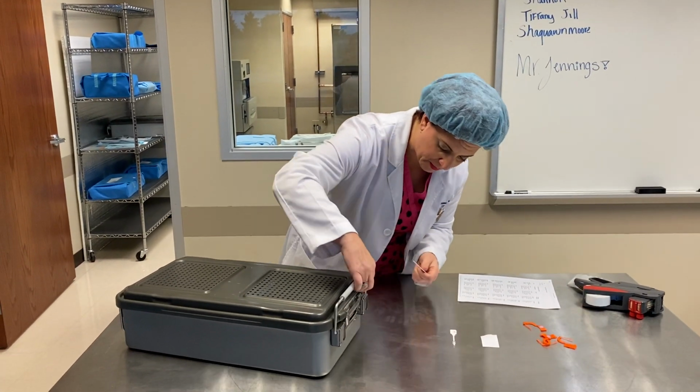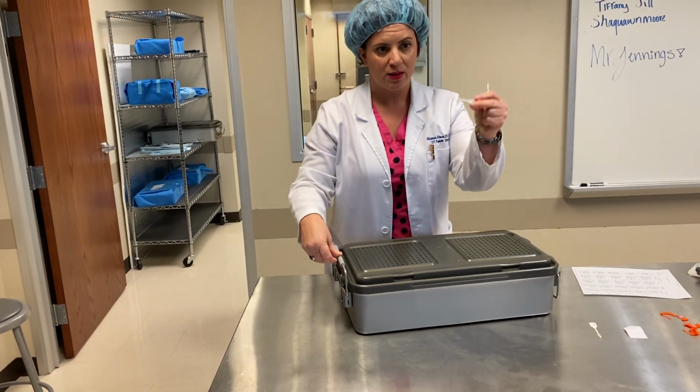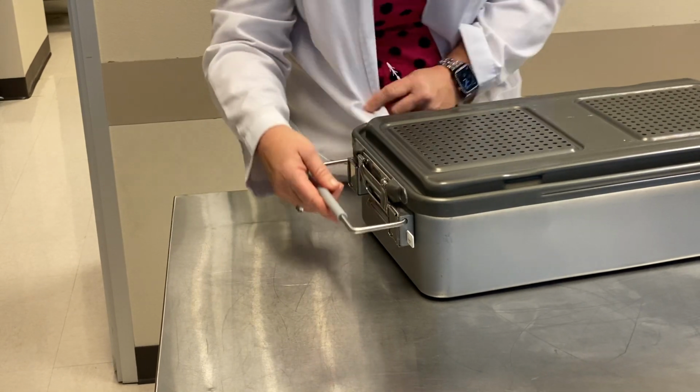So we look on this tray right here, there's a little slot right there. You can see that. This little arrow is going to slide into there and it's going to lock in place, all right?